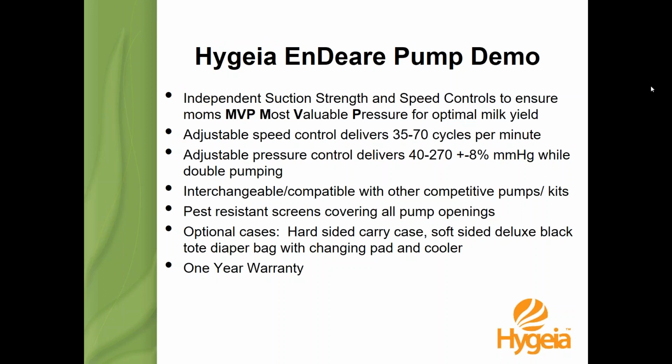All right. This is our piston. It'll come assembled like this, in an extreme close-up here. This is our strength knob, kind of upside down. Here's our strength. It's on maximum pressure right now. We can adjust this up or down. These 2 ports, where I've got them here, is where the tubing's going to go. If you want a single pump, we have to close one of those off.